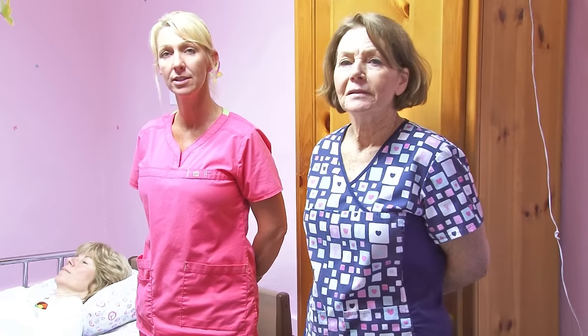Hi, I'm Beth Doman. I'm the Health Care Services Director at New Horizons Village, and today we're going to be doing a short training on the Hoyer Lift, newly purchased by New Horizons Village for some of our residents who are becoming non-ambulatory and need assistance being transferred.